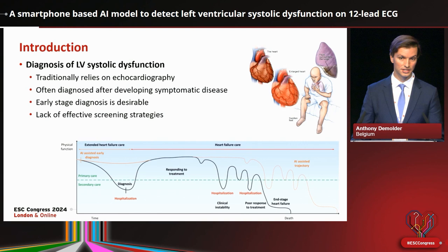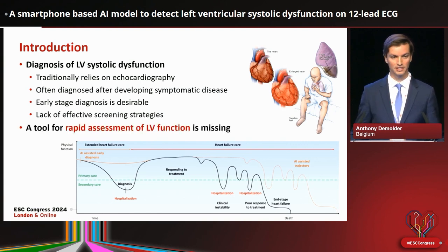We also know that there is currently a lack of effective screening strategies present, and that is because there is no tool for a rapid assessment of LV function that is available in primary care or that is readily available to anyone.